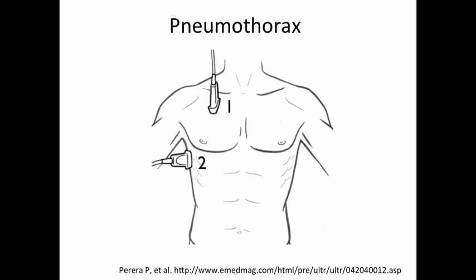Additionally, if there are patients who are post-surgical, such as many of our lung transplant patients, they may actually develop loculated pneumothoraces. And so again, those are patients in which it would be important to go not only at a two-point exam, but follow the mid-clavicular line and mid-axillary line all the way down to the diaphragm.